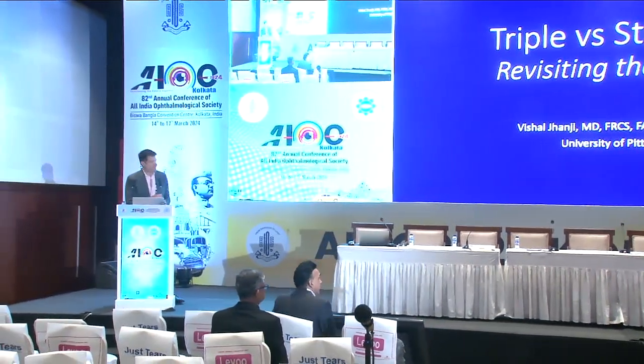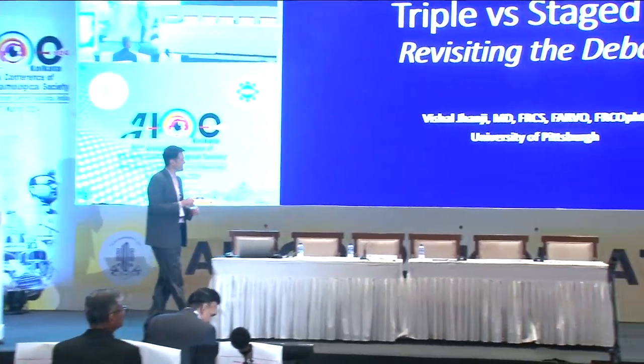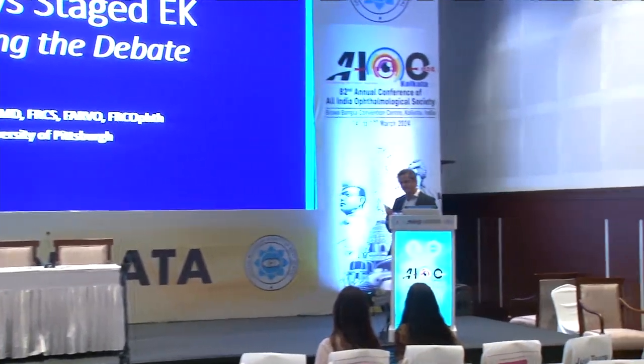Yeah, we discussed some of this stuff that we wanted to discuss, but that's great. One thing about LALs in that paper from Frank, would you guys think that if I have to do an LAL, at least for the first 20 cases, I'll probably not do a triple and do a staged procedure? So you figure out the graft is okay, 3 months later you can do an LAL. Or you'd rather prefer a triple if you're doing an LAL. I don't know how difficult the adjustments are. If you have 4 shots at adjusting the lens power, when do you start adjusting the lens power, Audrey? Yeah.